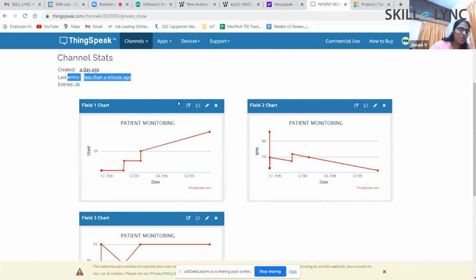I think most of the people who have worked know very well, if your speed is very low, it takes some amount of time. The MAX sensor itself has a jitter of 10 seconds. So I made it in such a way that my baud rate is high and I gave a 20 seconds delay in the program. And then I gave it to the ESP so that only a small delay of half a minute was there. And again, depending upon your cellular data connection, the data will be displayed in this dashboard.